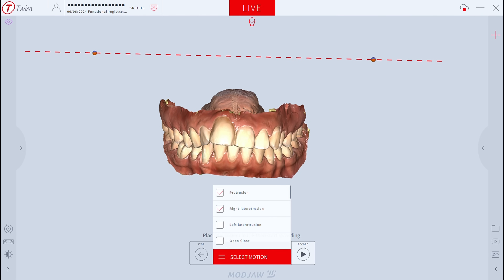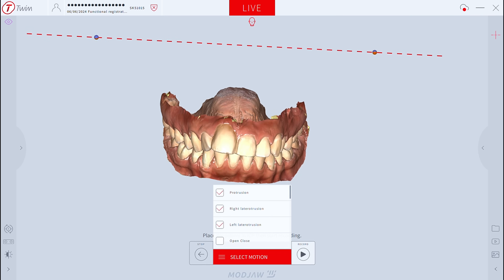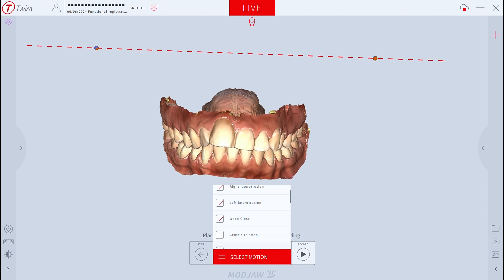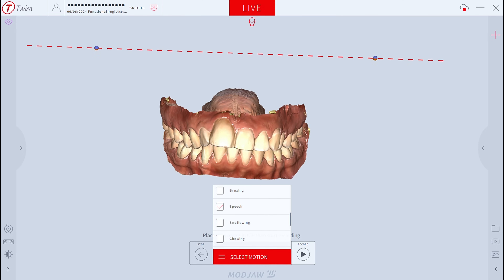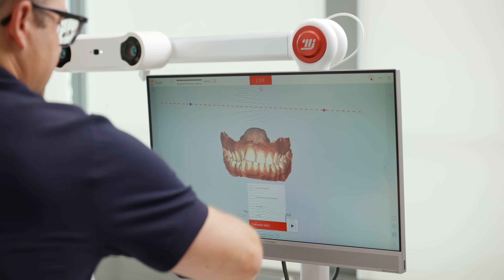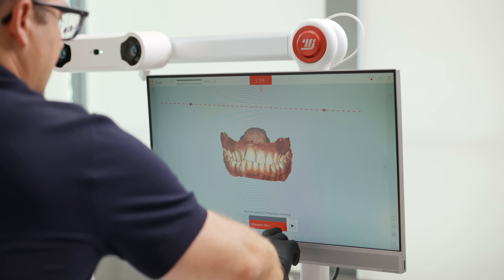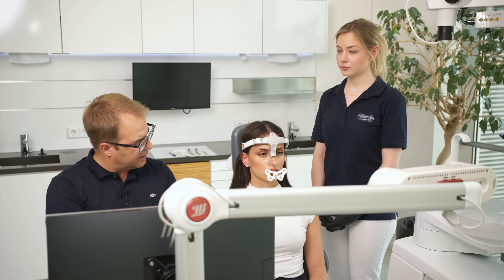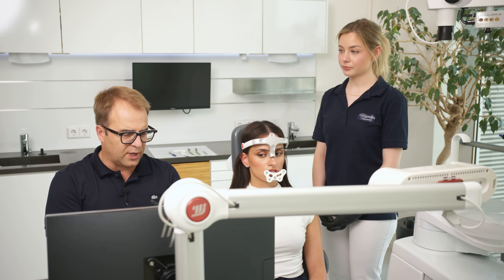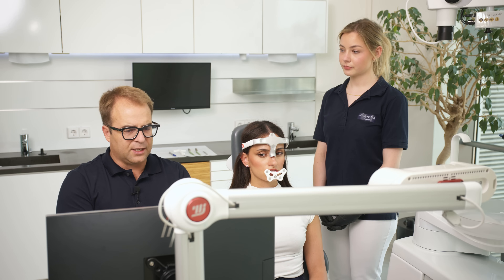I will now select the motions to perform: protrusion, right lateral protrusion, left lateral protrusion, open-close, speech, chewing, and free movements. We'll start with the protrusion — first, a practice run without recording. When you start moving, the camera registers every movement.